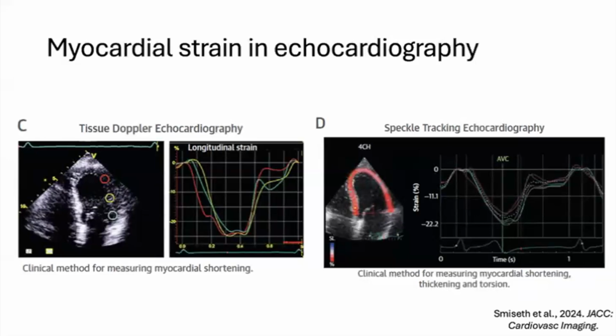Now, as I'm sure most of you know, also from the chat from last week, strain analysis in echocardiography in today's era is almost exclusively done through technology called speckle-tracking. It's important to remember speckles are not actually particles, but are caused by interference patterns between cells of different ultrasound densities. They move together with the tissue for a limited period of time and distance, and that's why they're used as features for tracking.